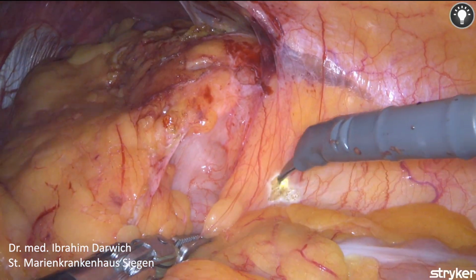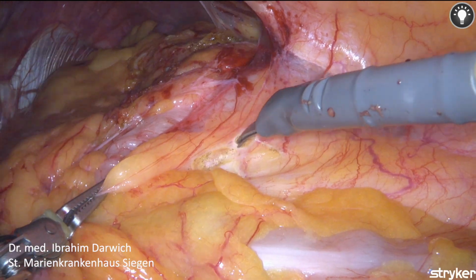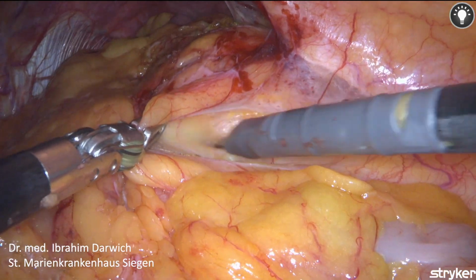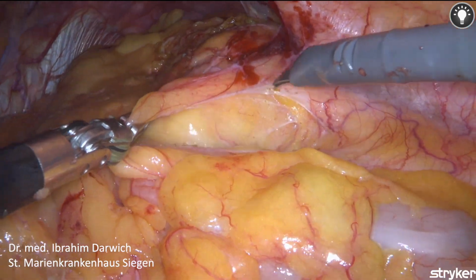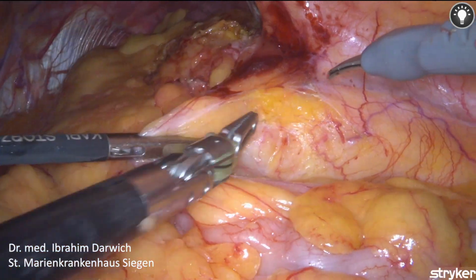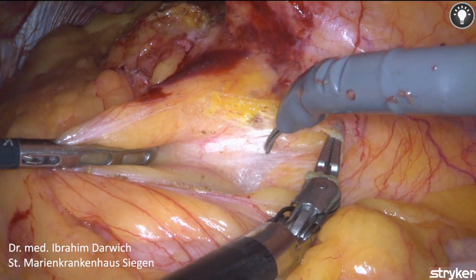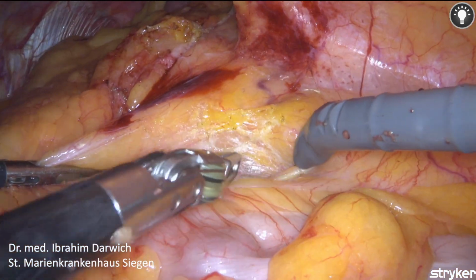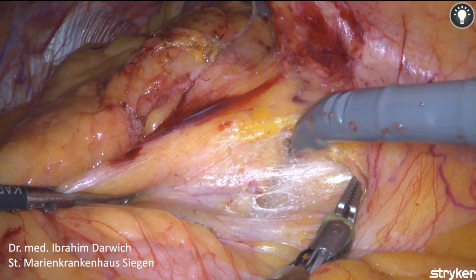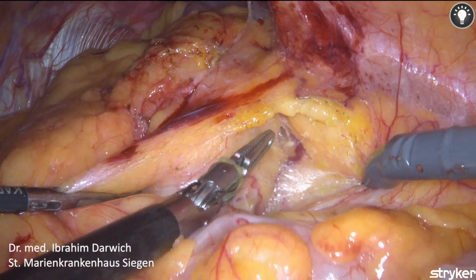The peritoneal margin between the lateral border of the colon and the anterior renal fascia can now be clearly visualized, and dissection along the avascular space is performed to take down the splenic flexure. The surgical assistant standing on the right side of the patient is providing the necessary countertraction in order to perform a bloodless monopolar dissection with the ArtiSential scissors.